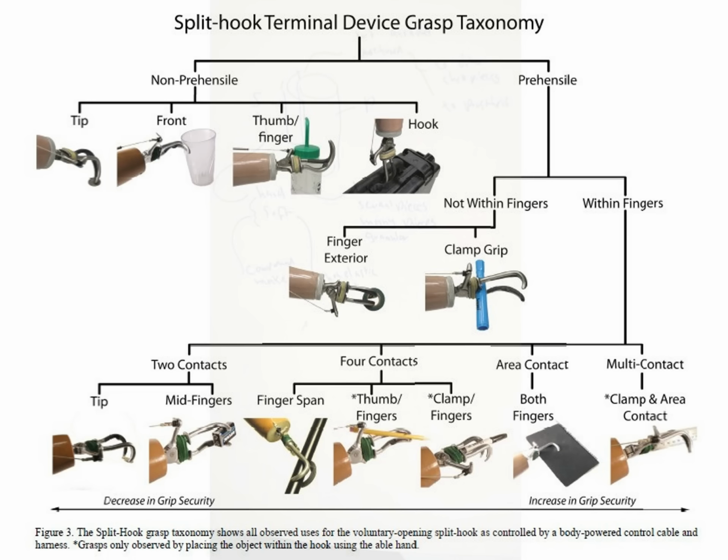Grasp power. Okay, this is the grasp power. We have just asked you to measure your grasp power with this device, which we call the dynamometer. You can see everyone got a number for the right hand and the left hand grasp power, which can be used to design how much power you need to grasp something with your hook.